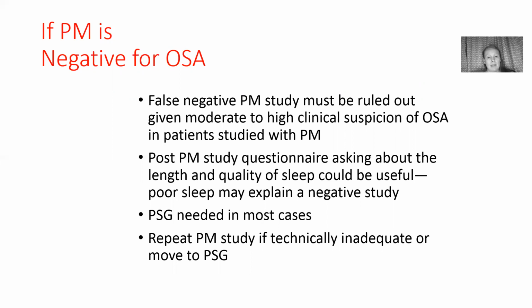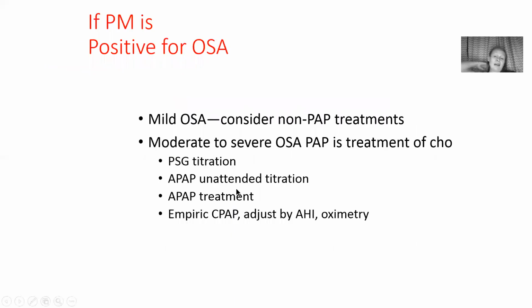In some cases, this says in most cases, and I would disagree with that, in some cases an in-lab sleep study is needed. Sometimes they will just repeat the home sleep study if they think it's technically inadequate, or they could do an in-lab study, but a lot of times they know insurance isn't going to reimburse based on the patient's insurance company, so they'll just re-perform the study at home.